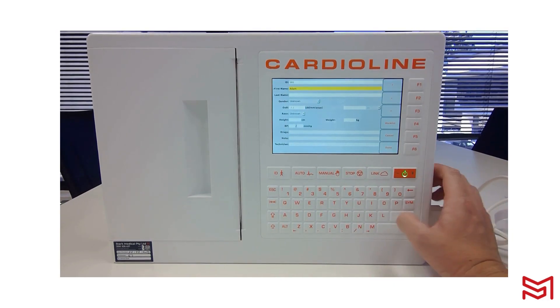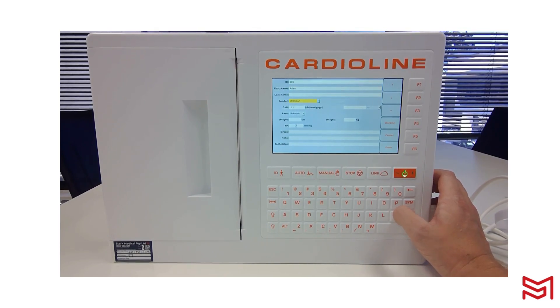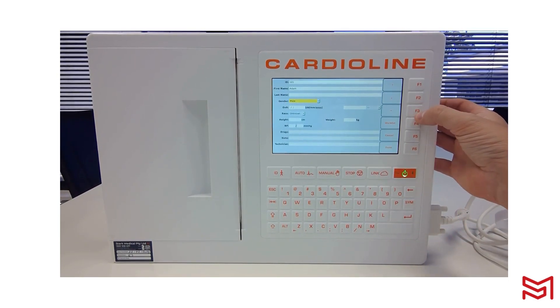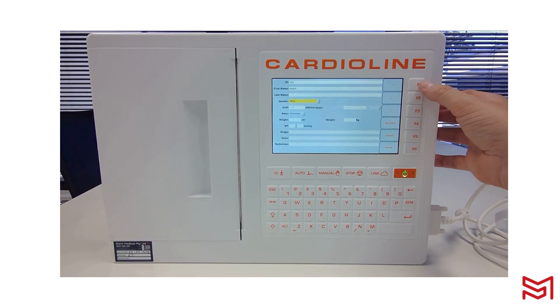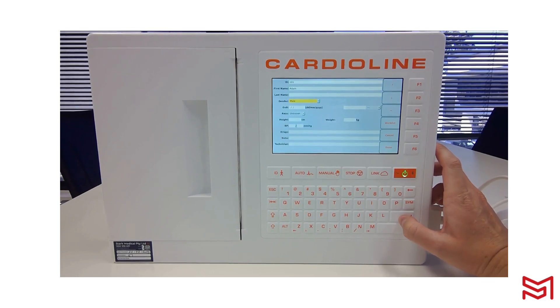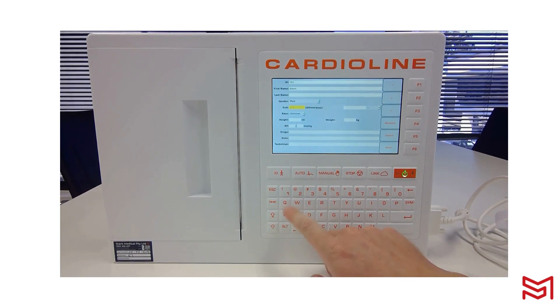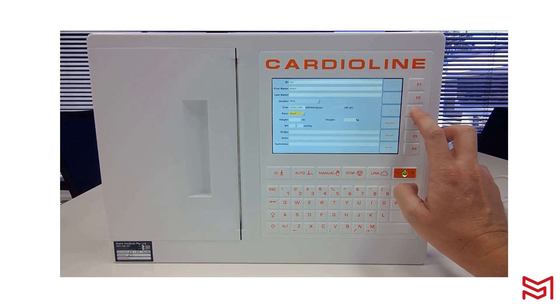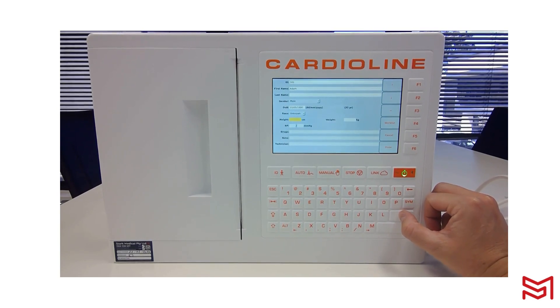The device comes standard with Glasgow Interpretation. For an accurate interpretation, you need to enter gender, age, and race — they're not mandatory, but I would recommend it to activate the Glasgow Interpretive Algorithm every time. You can type the value or select it via F3 to use the drop-down. Navigate up and down with F1 and F2, or push Enter to move to the next field. Enter your date of birth, click Enter to populate the age, then enter race — or leave it unknown. Click Done once you've entered all the fields you wish to enter.